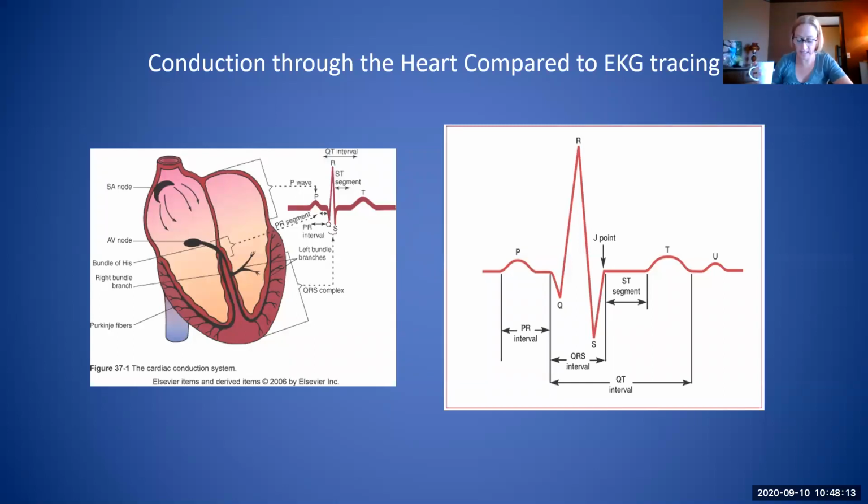Then you have your ST segment, which represents early ventricular repolarization. So it's the start of the filling of your ventricles. Then your T wave is the resting state of your heart. That is your ventricular repolarization. So that is your heart at rest.